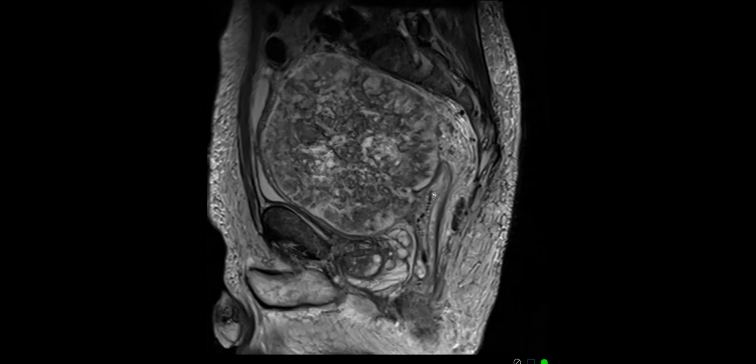And it's CD117 negative as well. And SMA positive is kind of non-specific. It is smooth muscle actin, so it's positive for lesions arising from the myoepithelial layer. As we know, there's mucosa, submucosa, right? So even in the mucosa, there is a muscle layer, which is called muscularis mucosae. So it has some of that component. So obviously it's the mesenchymal portion rather than the epithelial portion or carcinoma. So some weird tumor, yeah.